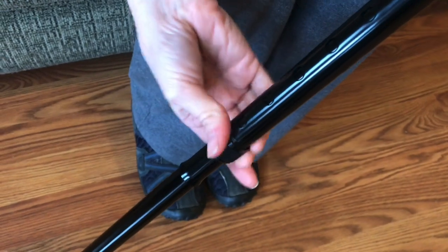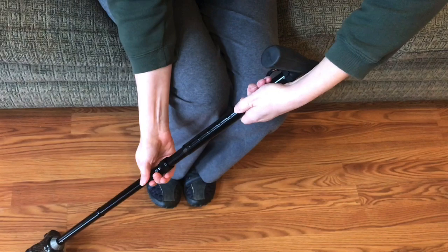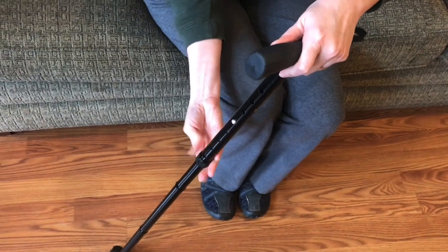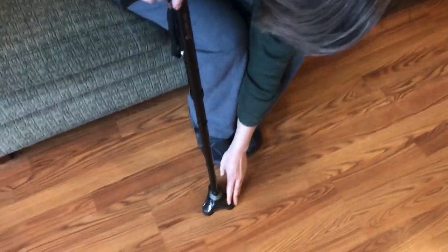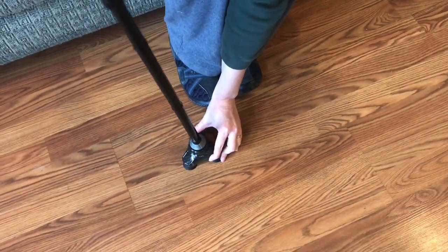Unscrew the safety collar and adjust it to whatever height you would like. Re-secure the safety collar nice and snug, and it pivots somewhat as you walk too — it tilts slightly.